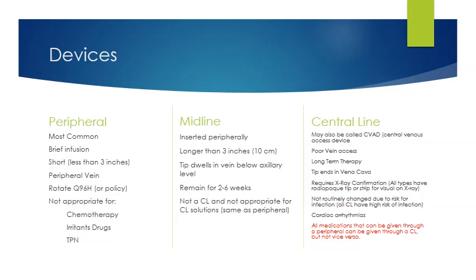All central lines give your patient a higher risk for cardiac arrhythmias, and think about that. Why would a central line have a higher risk for cardiac arrhythmias? So pause this and think about that for a second, and then come back.